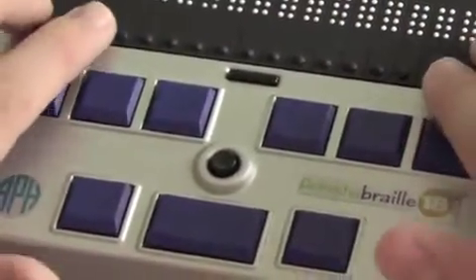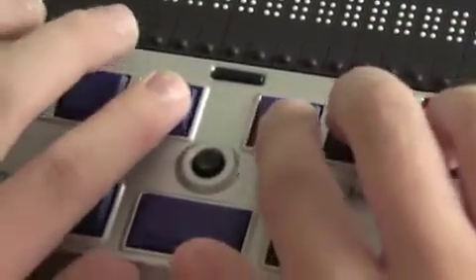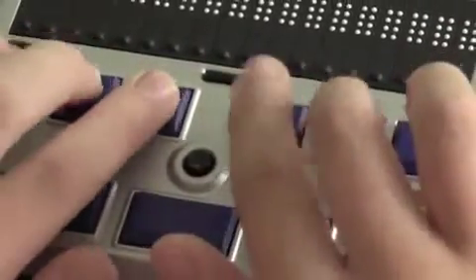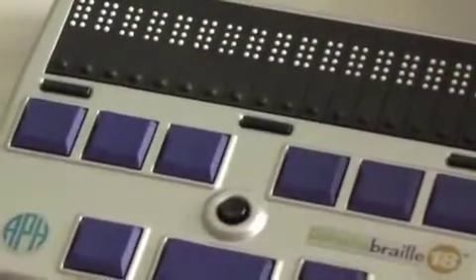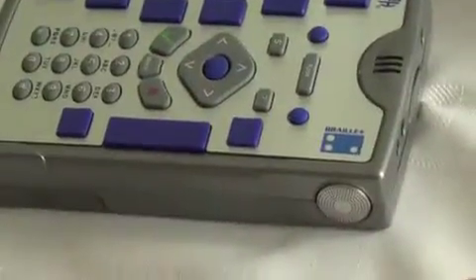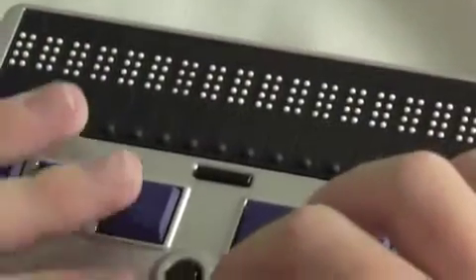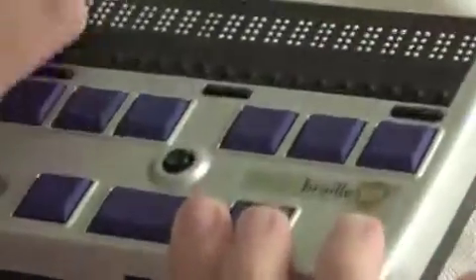The keys are also much quieter. If I type my name — you can hear that's much quieter, more like a laptop, than the keys on the Braille Plus. So if you're in a meeting or a classroom and you have a Refresher Braille 18 with you, this might be easier for other people who are not used to the sound of your Braille Plus to put up with.